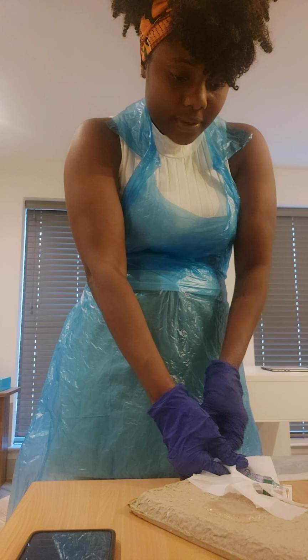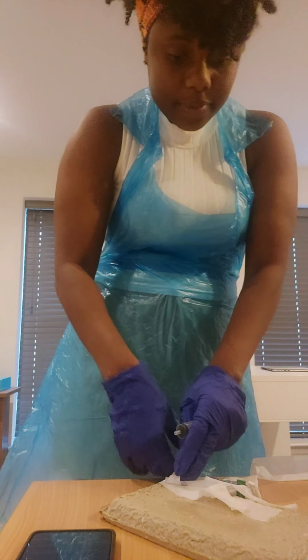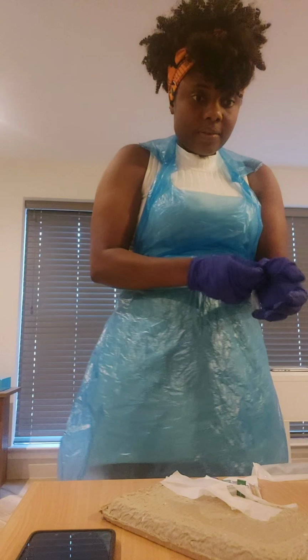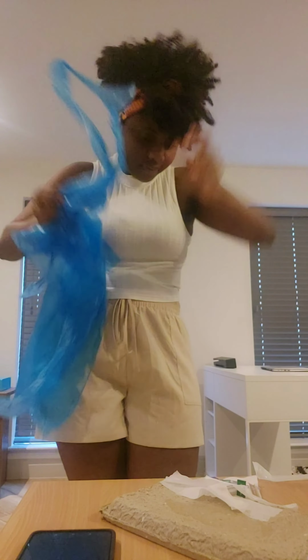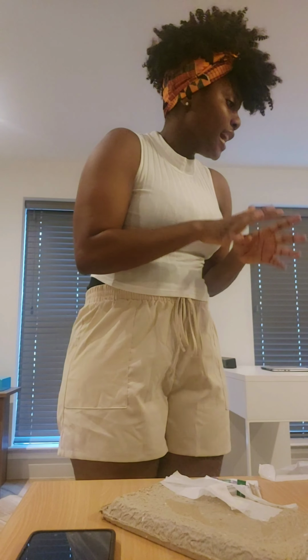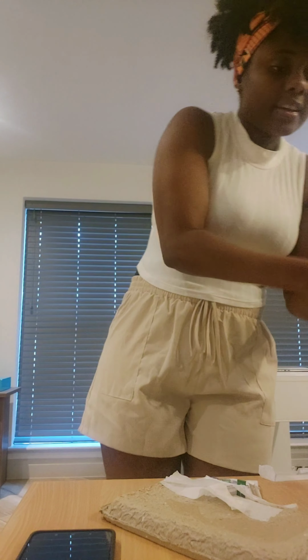I'm going to dispose all items into the clinical waste, and perform a hand hygiene. So as long as I can confirm that my tray and trolley is clean and ready for the next use, I'm going to take my leave. In case you need anything, kindly use the call bell and any nurse will attend to you. Is that okay? So I perform my last hand hygiene.